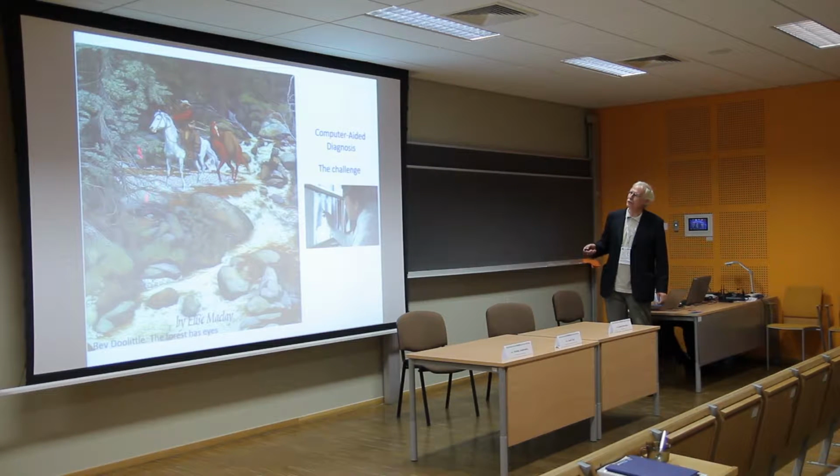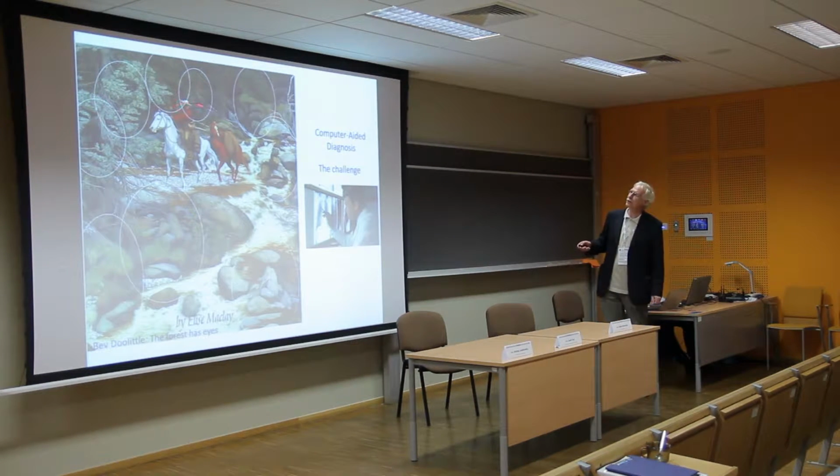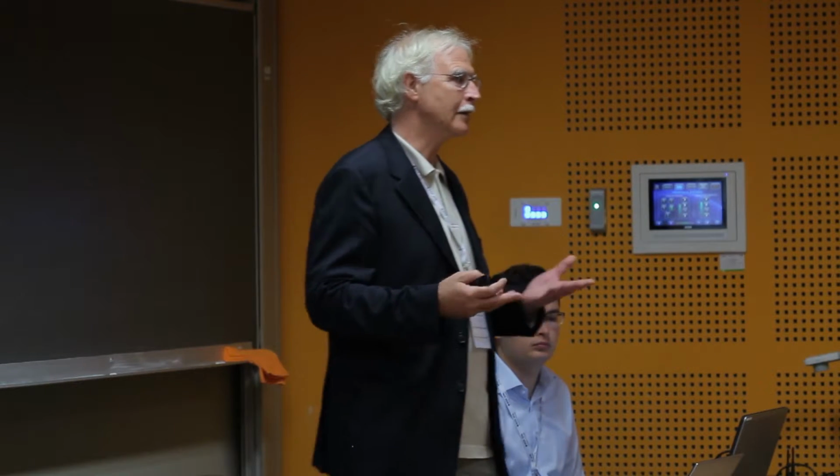And this is actually what a doctor needs to do when he finds the tumor. He needs to scan this image. And when you help him, you say, hey doctor, our computer vision algorithms have now found the spots, hey, look here, look here. And now you see, you didn't see this before, but now you see it. This is very difficult to see. So it really helps. And doctors are extremely happy with this help in computer-aided diagnosis.